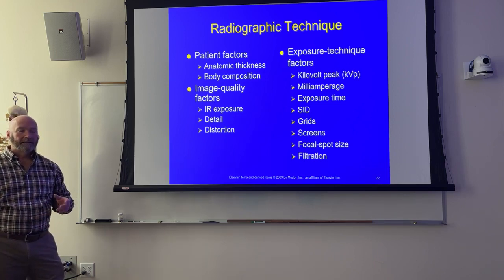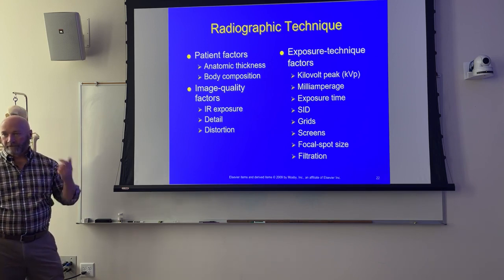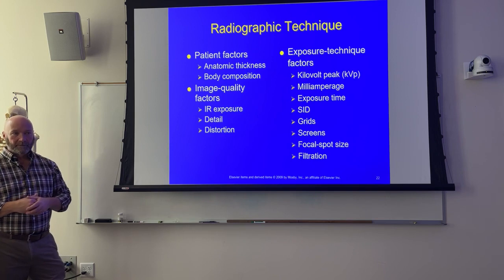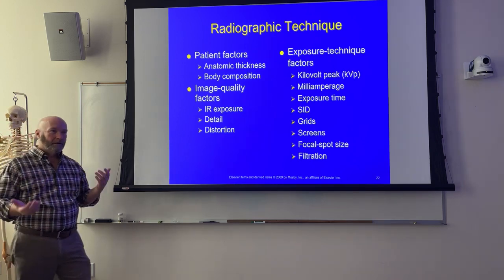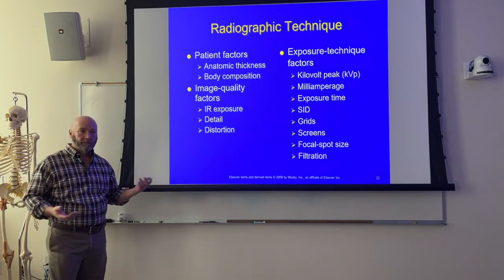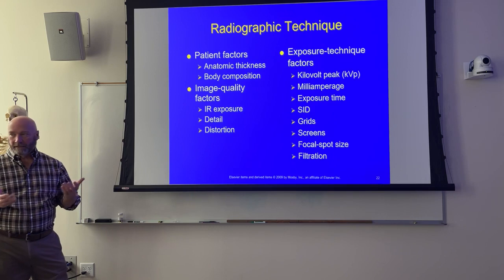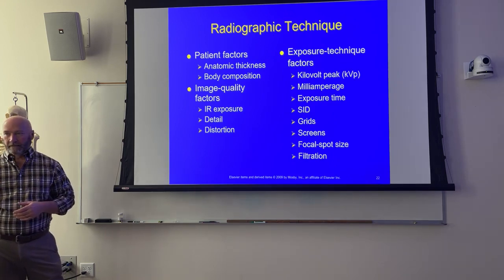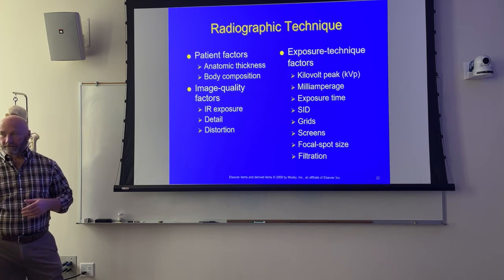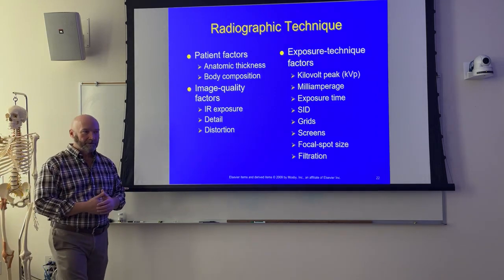When we're talking about radiographic density, nothing really affects the density, so to speak, anymore, except for the computer algorithm. So the technique doesn't really affect it, kVp or mAs. Index number, yes, but the actual density, not so much anymore. So if you see density, just make the mental note that it's image receptor exposure.